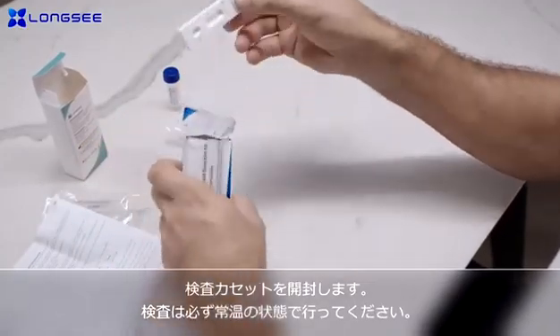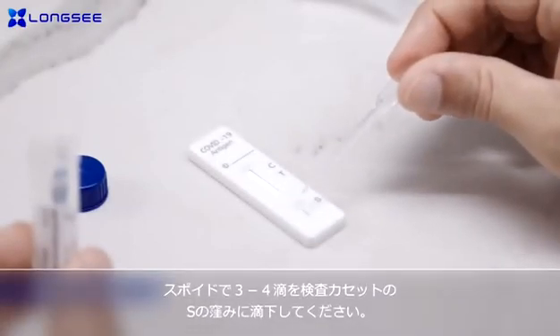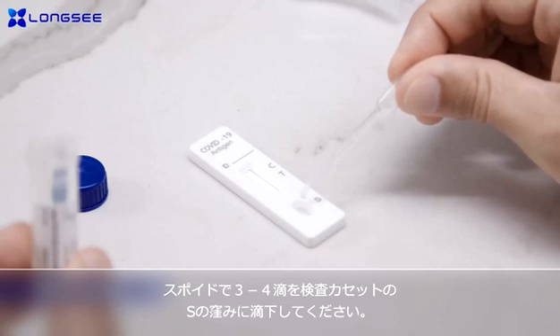Remove the nozzle cap. Drip three to four drops, about 100 microliters, into the specimen well S on the test cartridge.